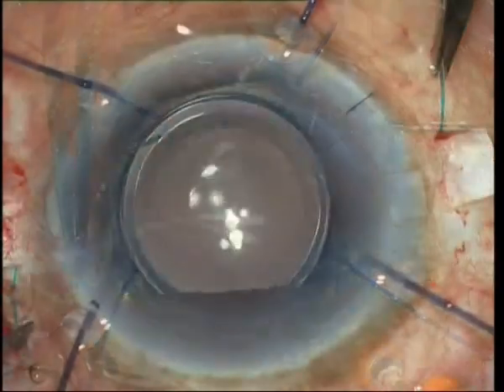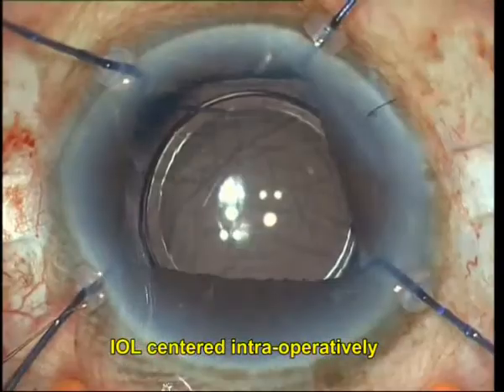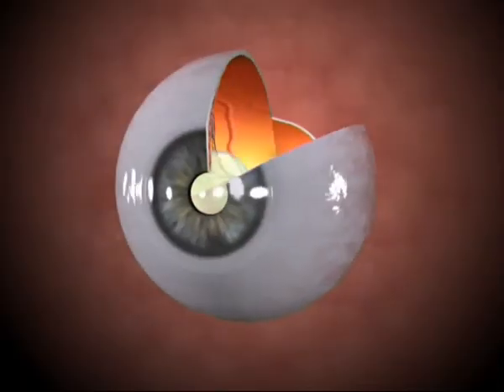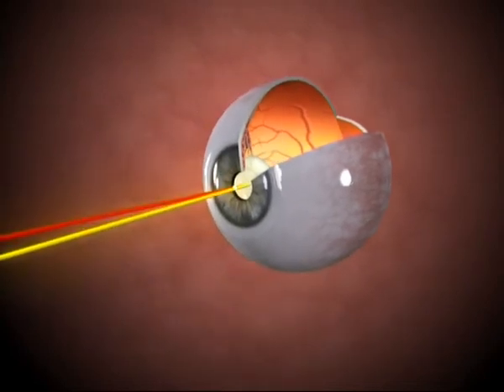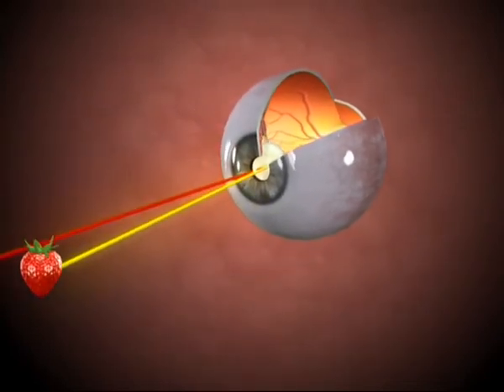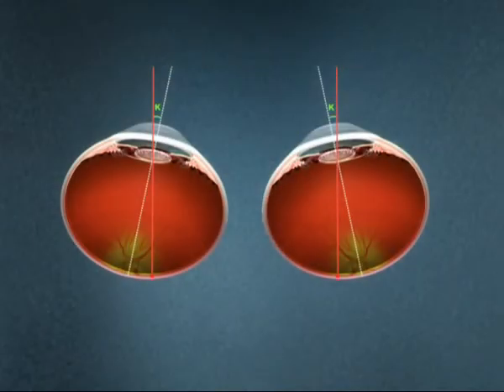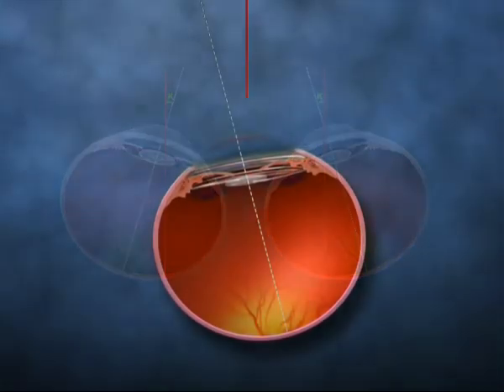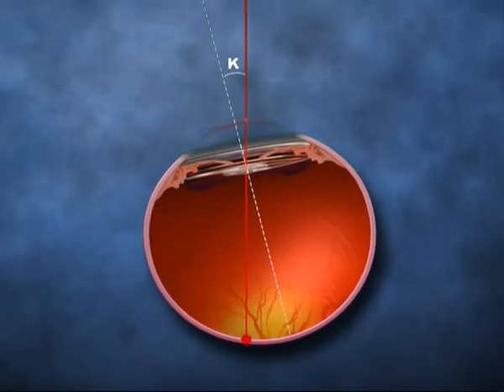It is important to focus more research on the association between angle kappa and multifocal IOLs. To conclude, we propose that it may be important to consider angle kappa for all prospective multifocal IOL patients, and to avoid multifocal implantation in patients with large angle kappa till the time advances make accurate centering of IOLs possible.